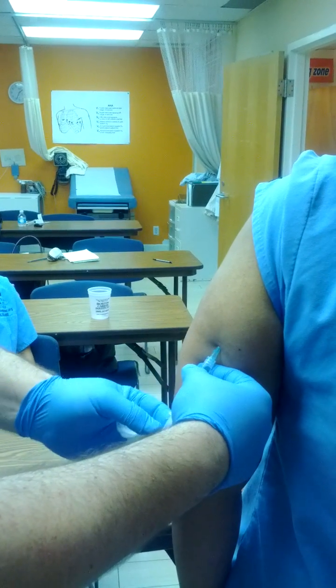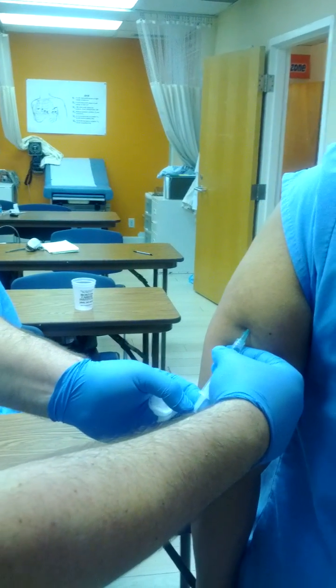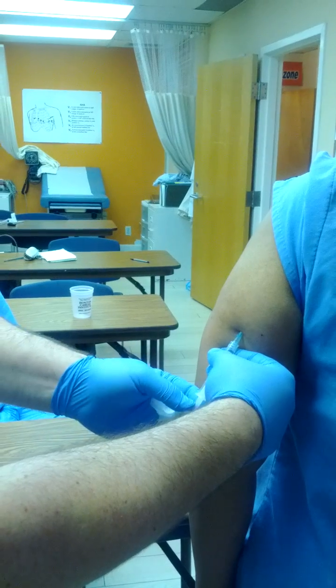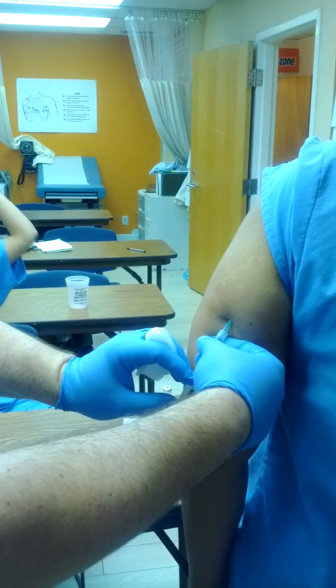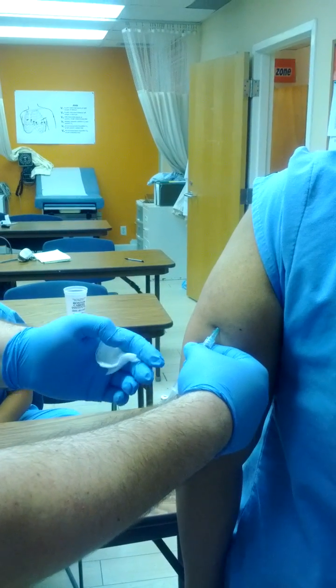It's all the way in. I'm going to aspirate the syringe, meaning pull back on the plunger. If I hit a blood vessel, it's going to show a little bit of blood flashing back into the syringe. But there is none, and I'm going to pretend to inject. The injections are always done slowly. The shot is quick; the injection is slow.